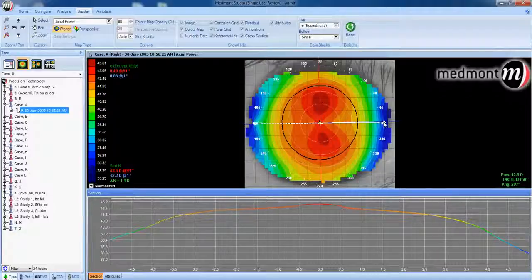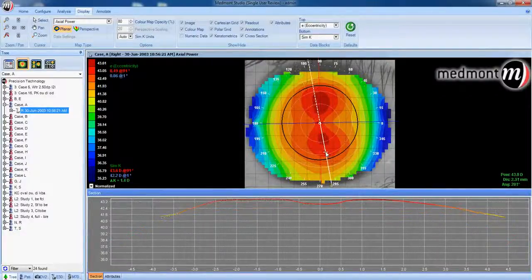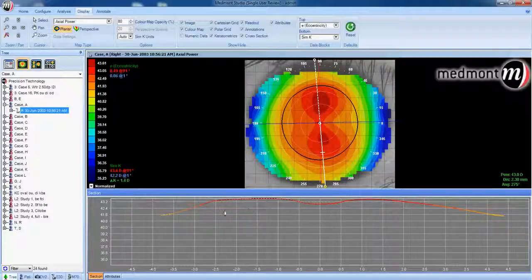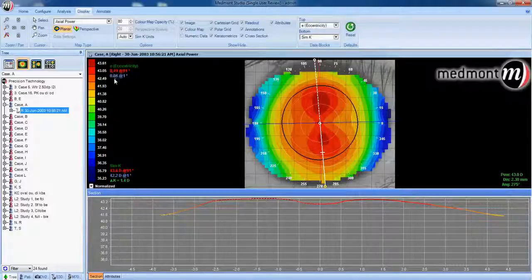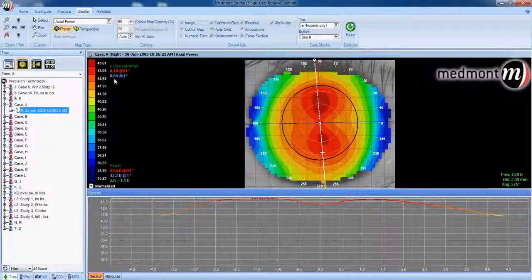Now, changing the axis line to the vertical meridian, notice there is very little rate of change from center to periphery along the steep meridian as compared to the flat meridian. That gives us a much lower eccentricity value. We will focus on eccentricity later in the video series to better understand what this tells us about eye shape and how it can help us in terms of contact lenses.